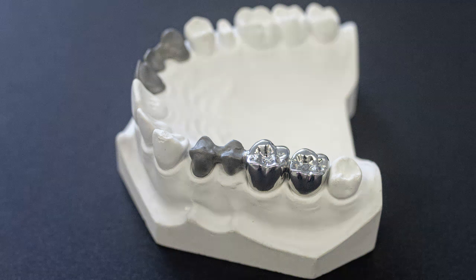The areas to be veneered remain dull, and all metal bridge units are polished to a high gloss. We do not show the ceramic veneering here.